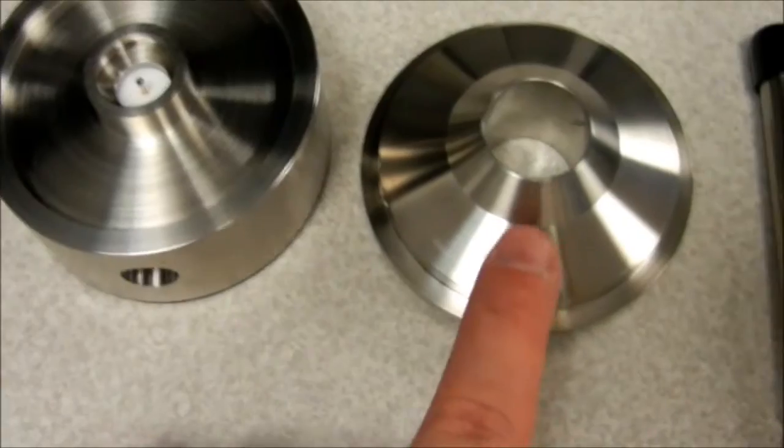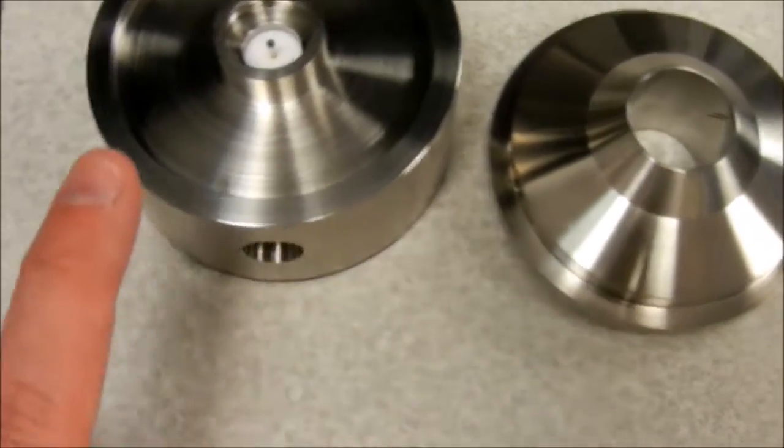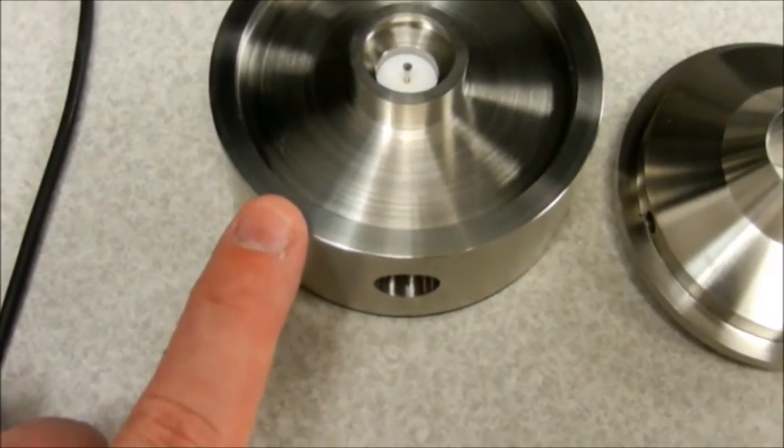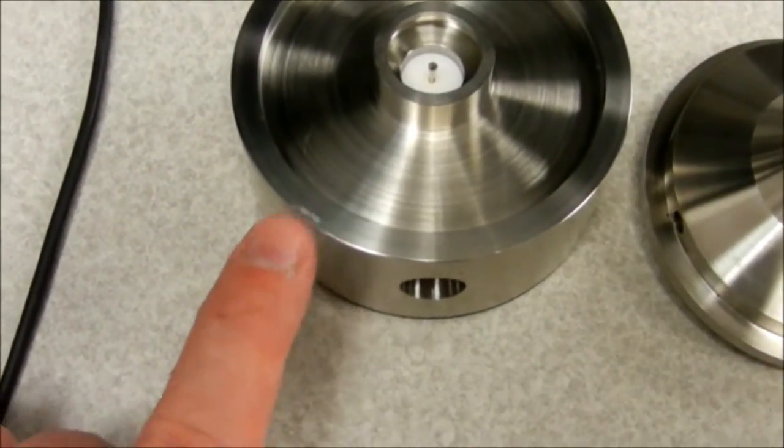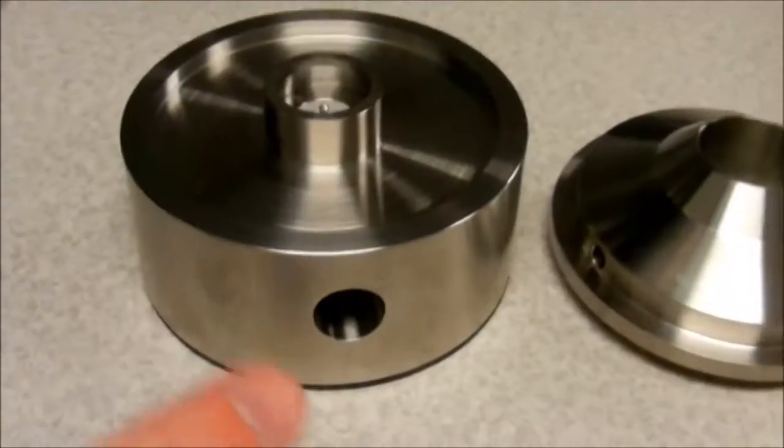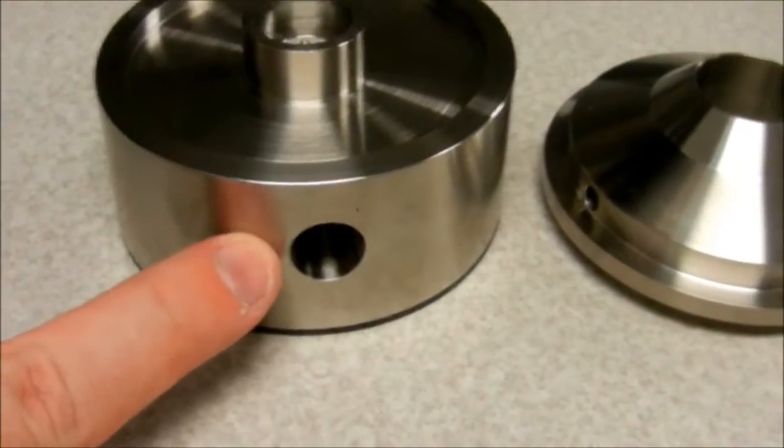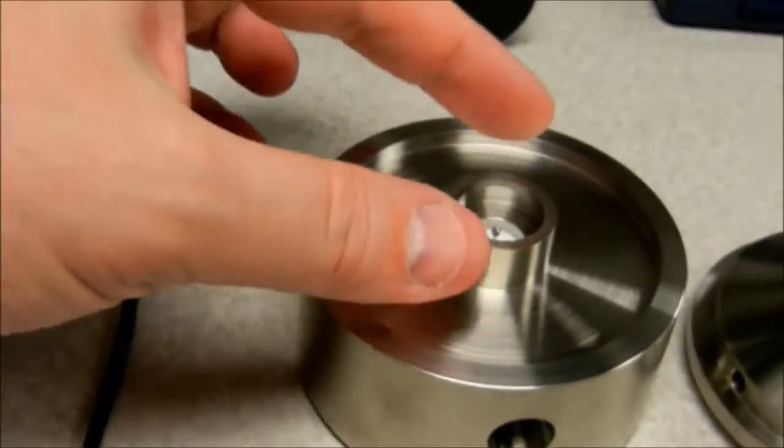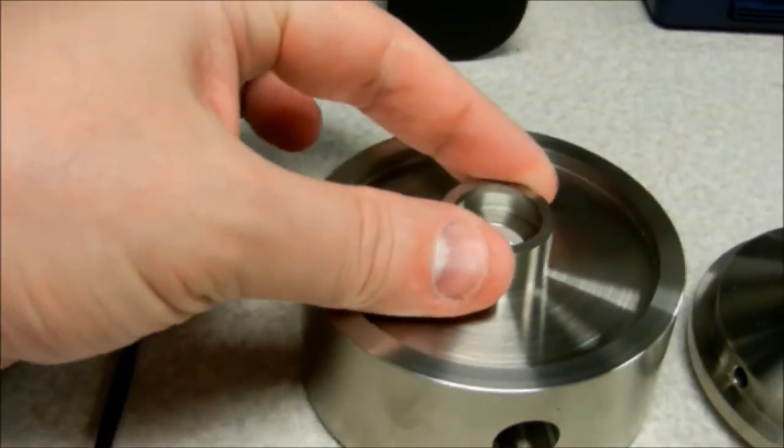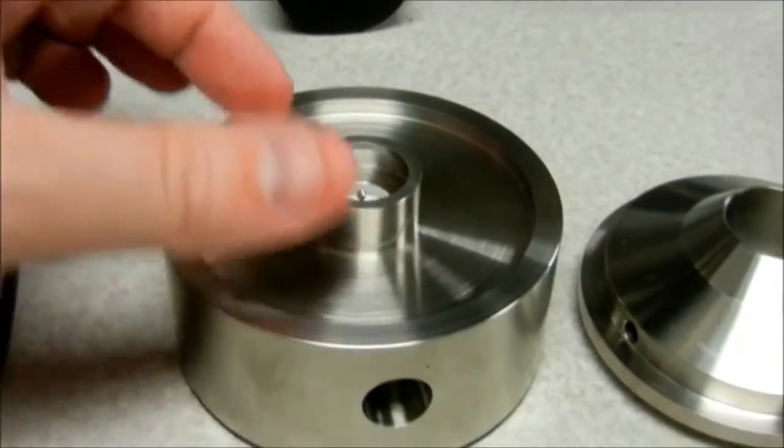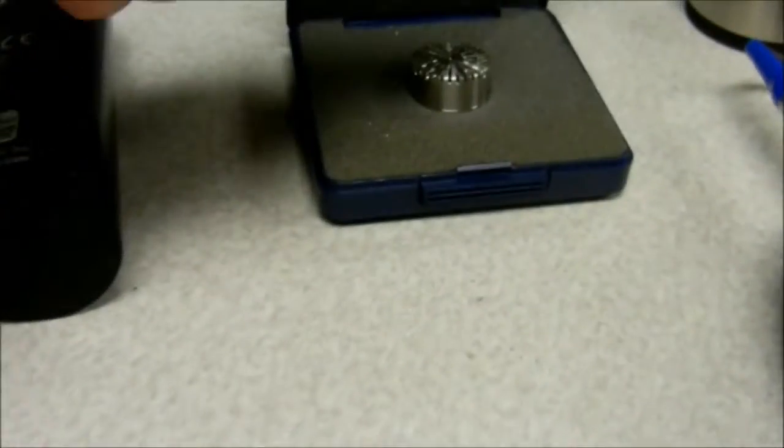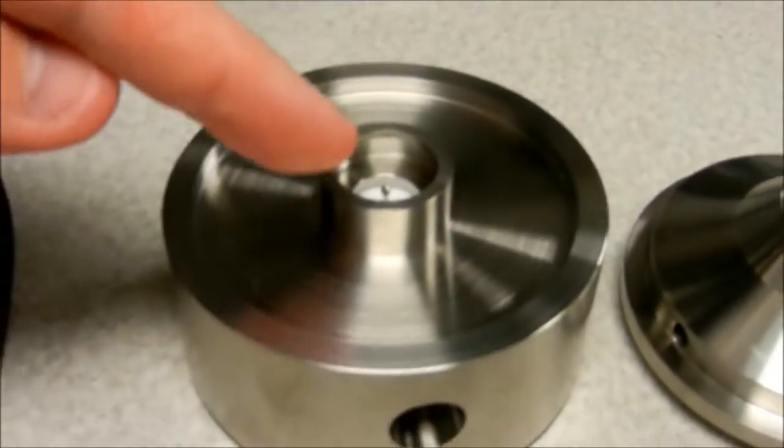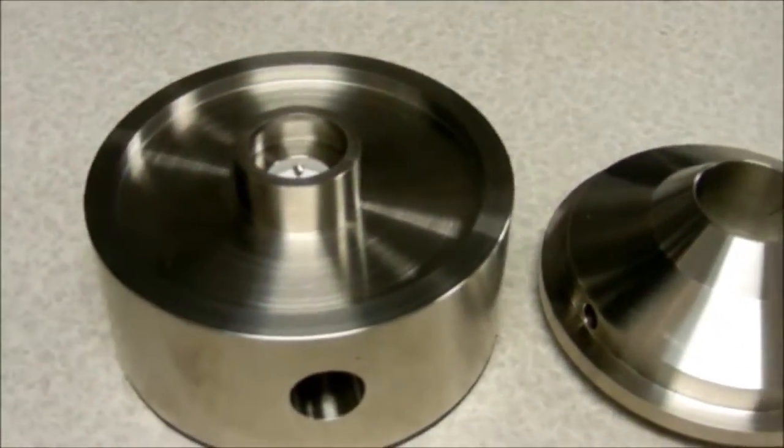We also have the coupler and this is the artificial ear. We insert the preamplifier here, unscrew this cap, and place the microphone on top.